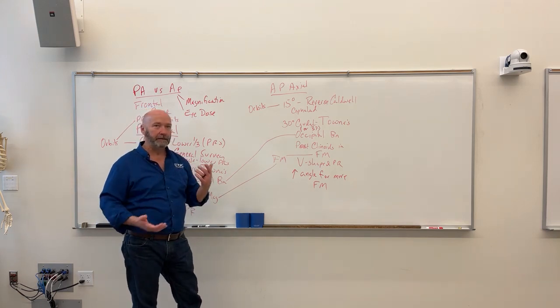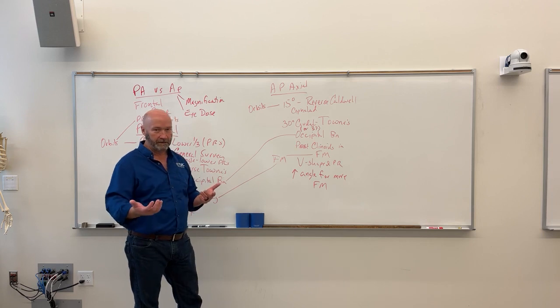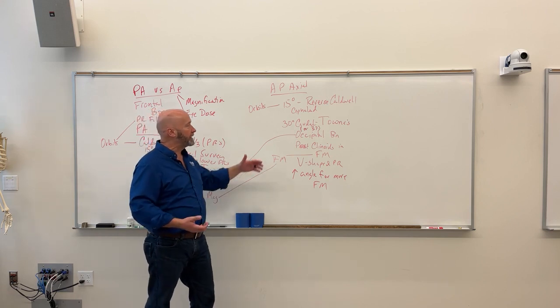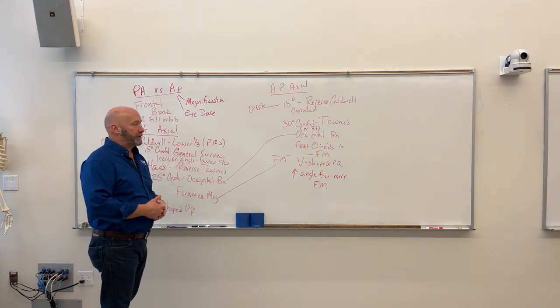Again, if you find yourself in a position where you're shooting skull work, the technologist that you're going to be working with may call something else a Caldwell. But just know that according to the test, 15 degrees is your Caldwell, right? So all the way through the registry, 15 degrees is your Caldwell.